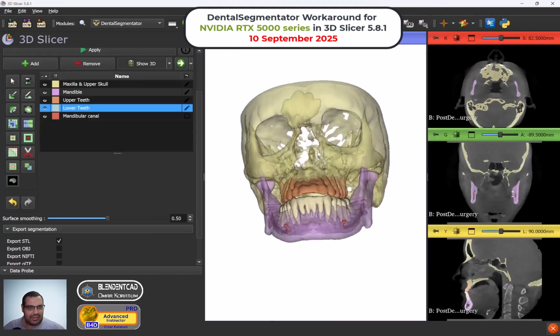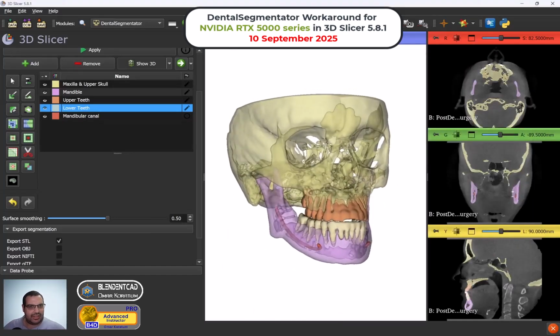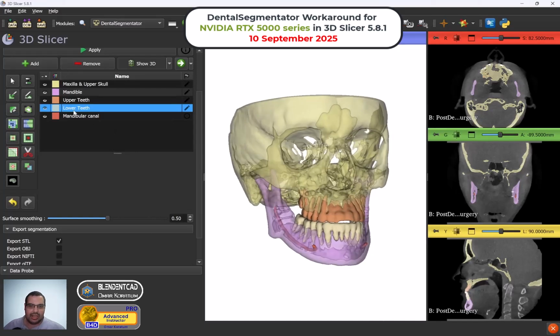And now, as you can see, the DentalSegmentator has finished the segmentation successfully. And this is due to the updated PyTorch.